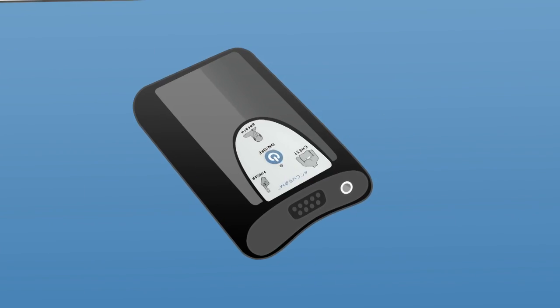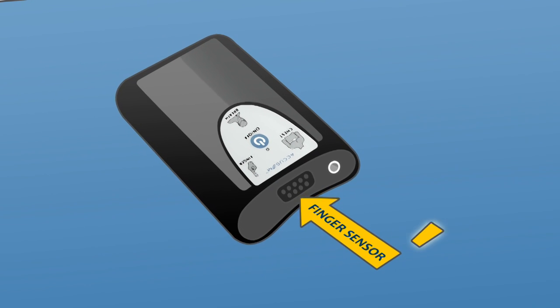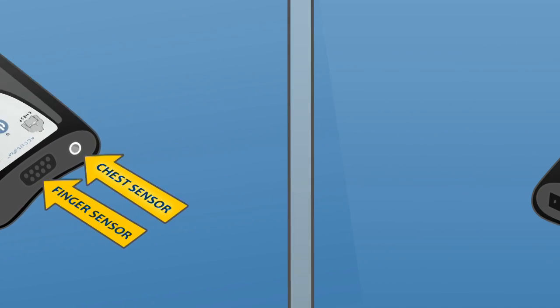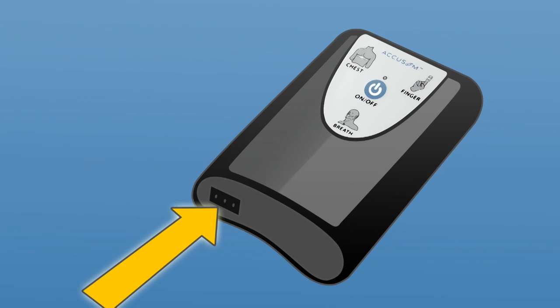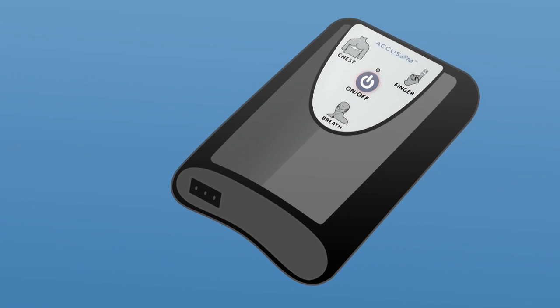The top panel has an opening to connect the finger sensor and the chest sensor. The bottom panel has an opening to connect the breath sensor. The on-off button is on the front panel.